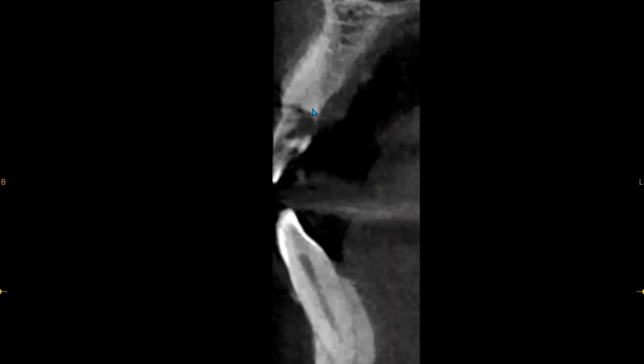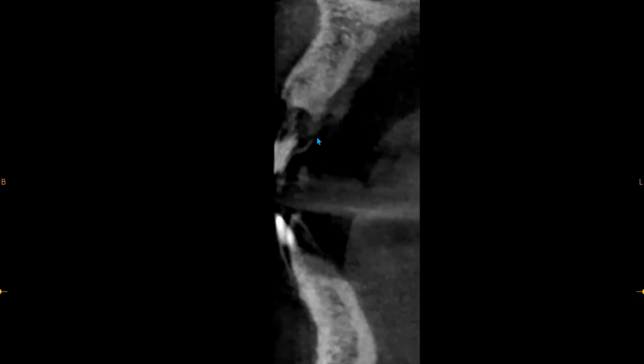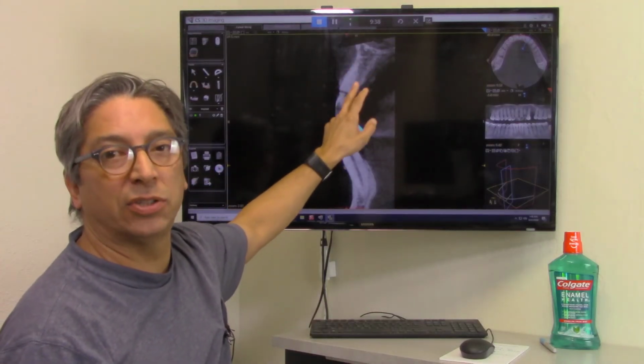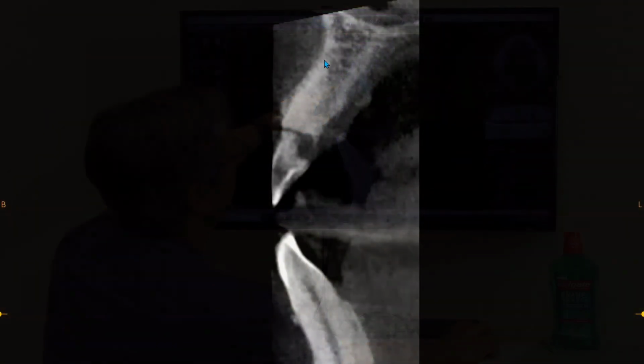But I want to look now here on the side. You can see how much decay and rot this is, but it's kind of interesting because this part is the cosmetic part. This is the chewing functional part. This is not. And by leaving this in, so long as this doesn't get infected, it won't destroy the bone. Actually, it's maintaining the bone out here in this area. Okay? Here, you can see the fracture clearly going across here and the decay of this tooth. It's kind of rotted away.